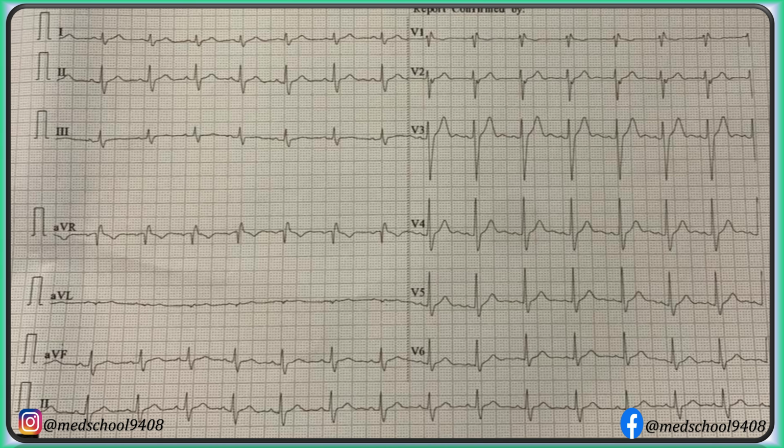In this ECG, there is RS-R' pattern in lead V1. S wave in lead V2 is slurred and its amplitude is reduced as compared to lead V3. There is slurring of S wave in lateral leads. But QRS duration is normal. That's why it is incomplete RBBB.